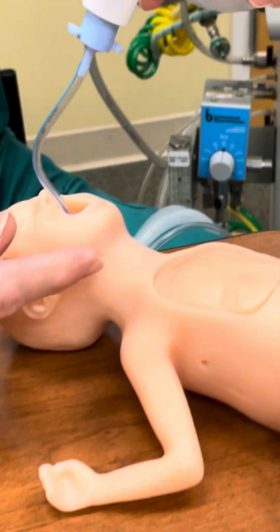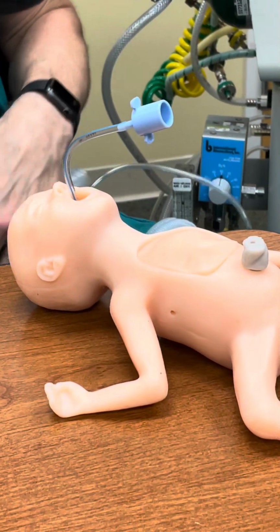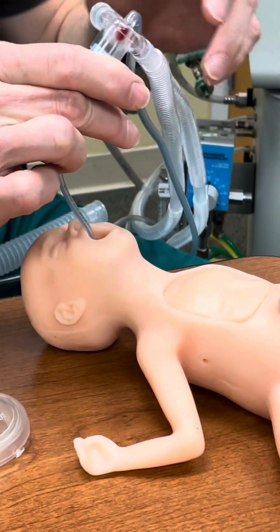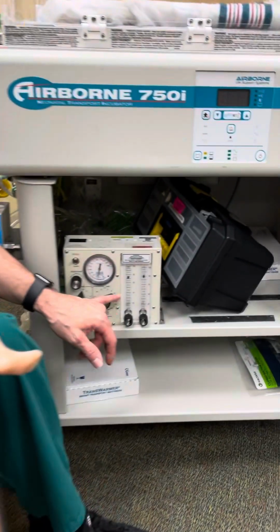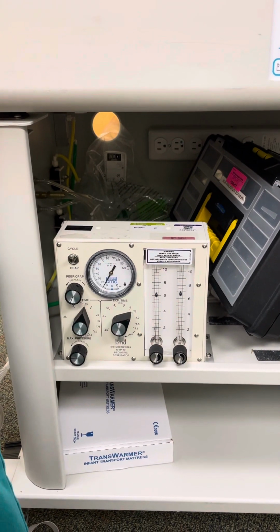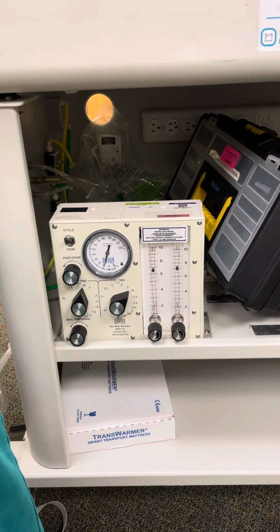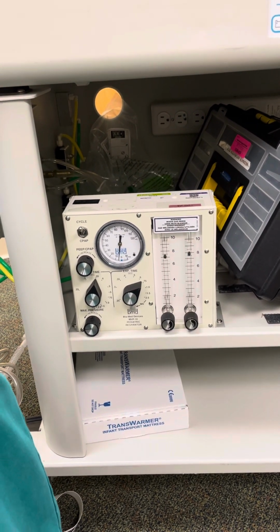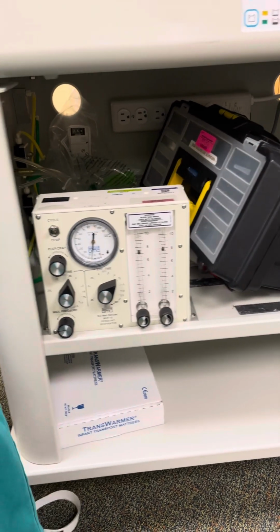See, got chest rise. So I just went from CPAP. Now I'm going to the ventilator. My pressures are all pre-checked, and as you see, my flows, you want to keep your flows about 8 to 9 liters per minute right there to get a good constant flow. These are time cycle ventilators, so your run time on these things is really good.